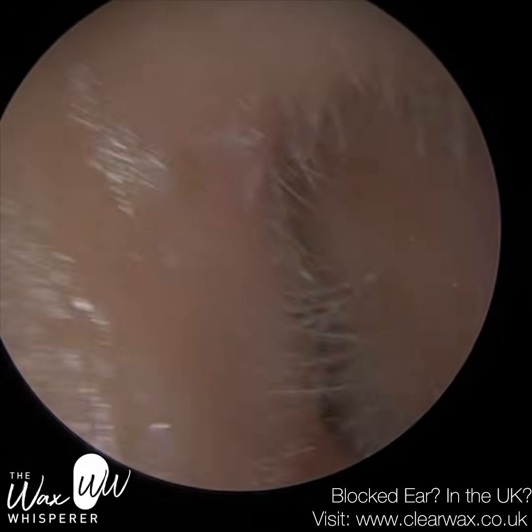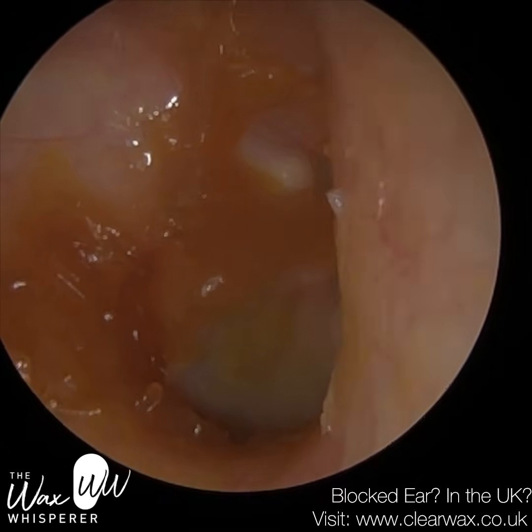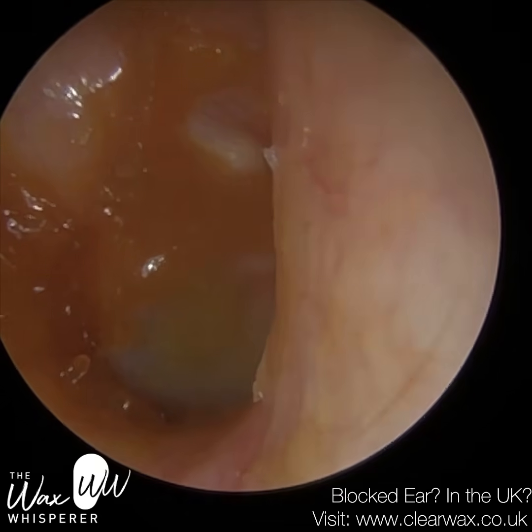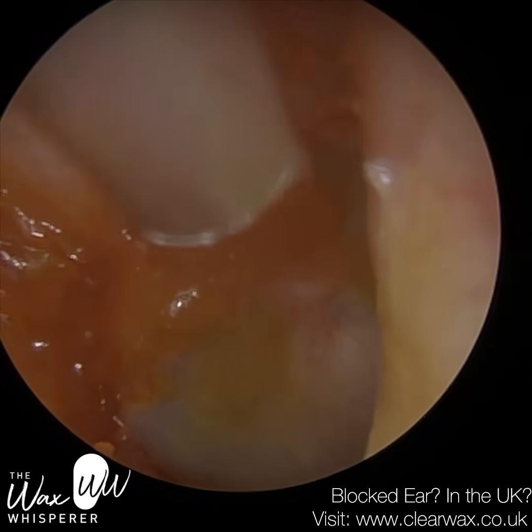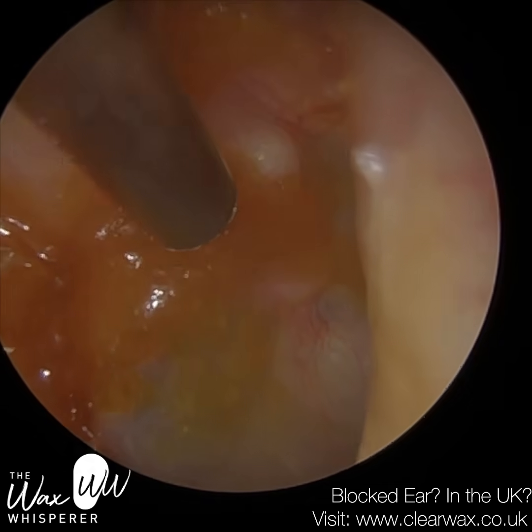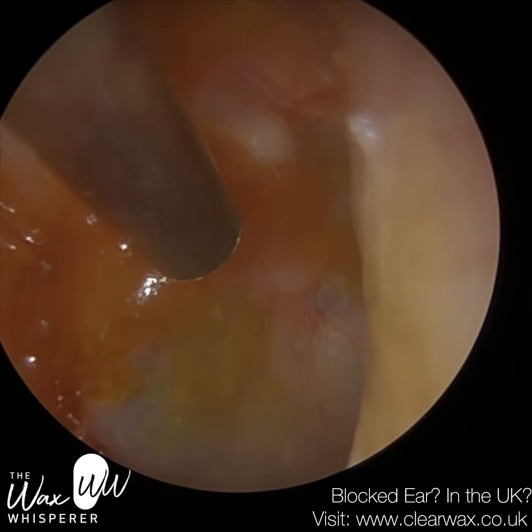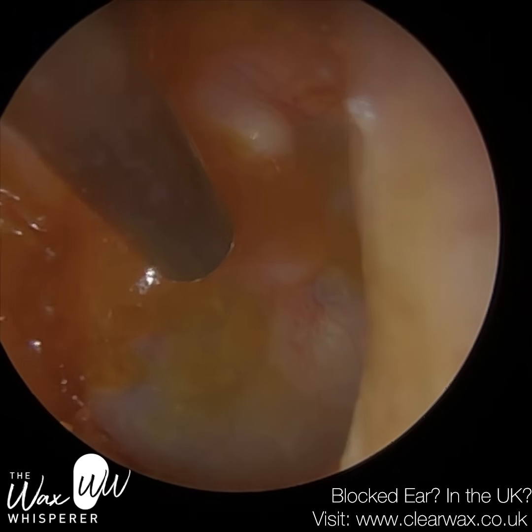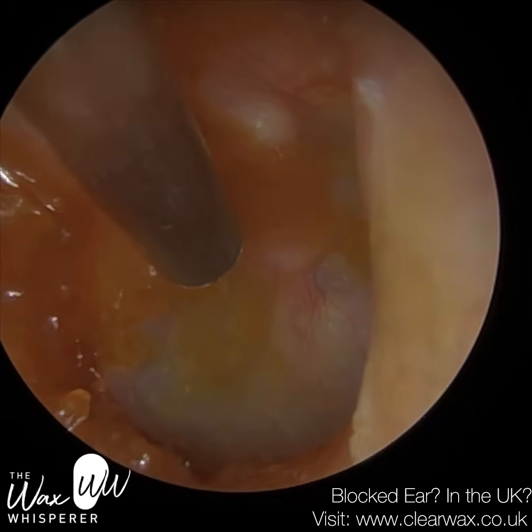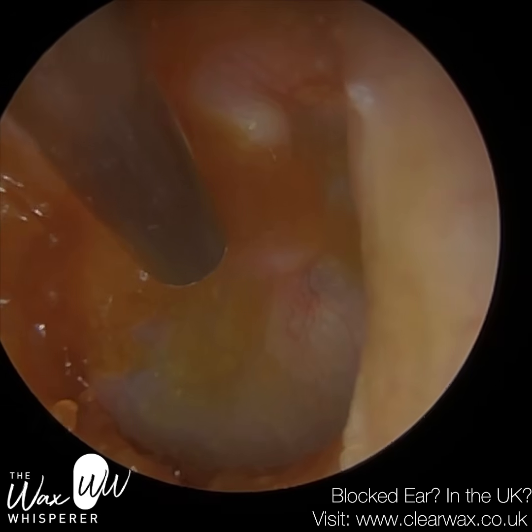Now I've cleared the occlusion, the patient can hear much better. You've got all this sticky wax keratin on the drum. We're just going to hover over, we're not going to be silly. There's a bit on the hammer bone itself, so we're just going to be careful there. You can see just to the right of the suction probe, that's the hammer bone. And you've got some wax. Now that hammer bone is attached on the underneath side of the eardrum. You make contact with that, it can be uncomfortable for the patient.